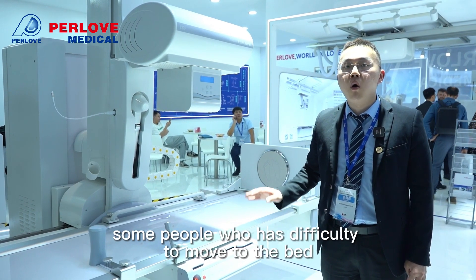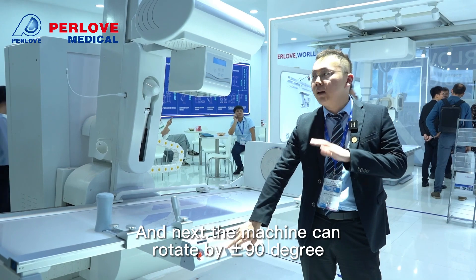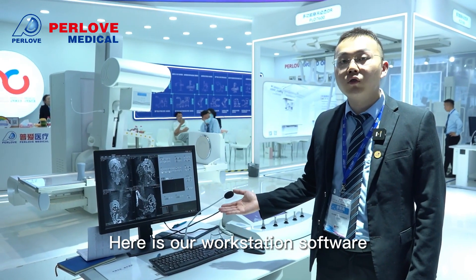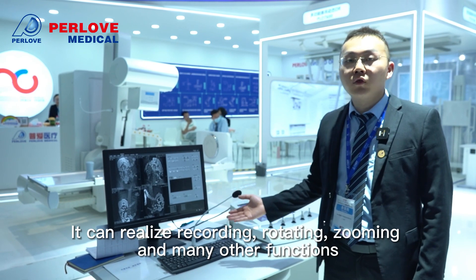This is also helpful for people who have difficulty getting onto the bed. The machine can also rotate by minus and plus 90 degrees. Here is our workstation software, which can realize recording, rotating, zooming, and many other functions.